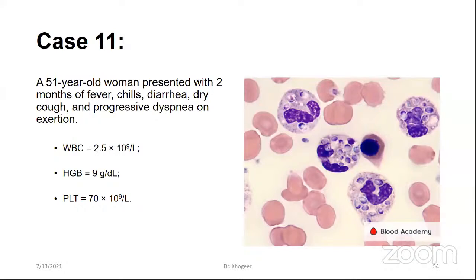Leishmania? No. Any other suggestion? Blue crystal? Okay. Malaria? No. Okay, so this figure is showing leukocytes phagocytizing yeast forms. This yeast form is Histoplasma capsulatum.